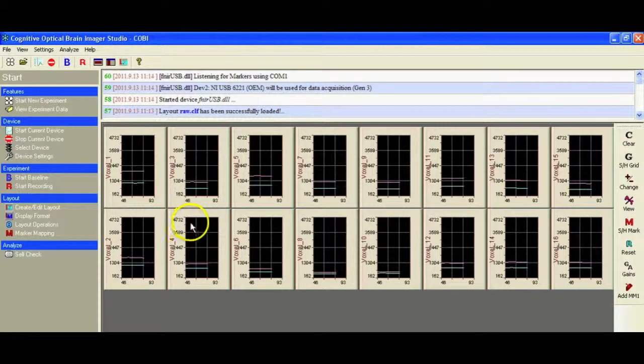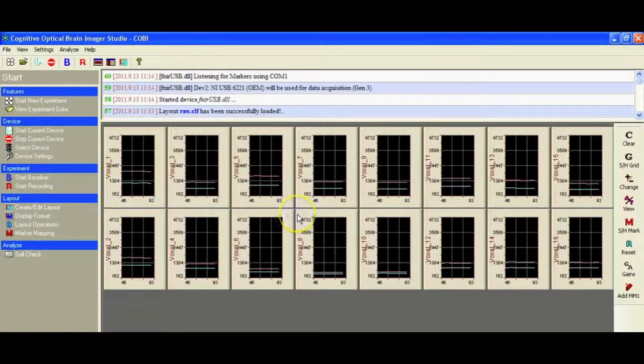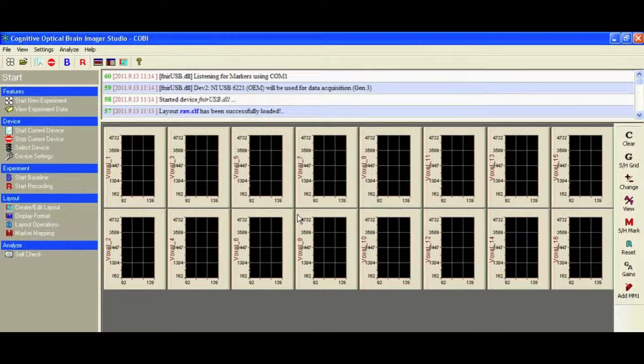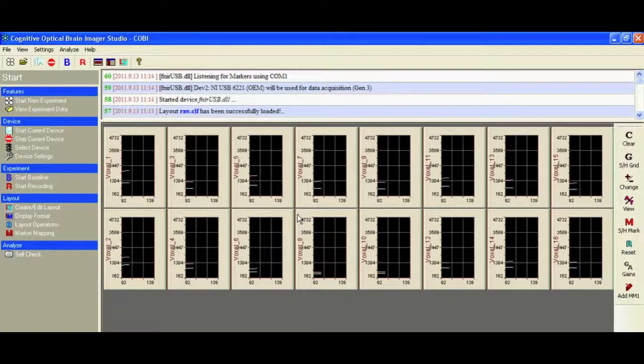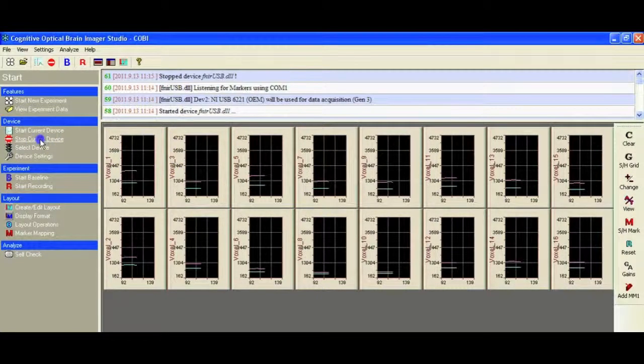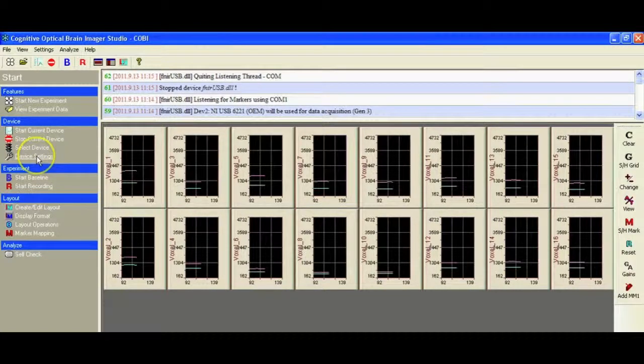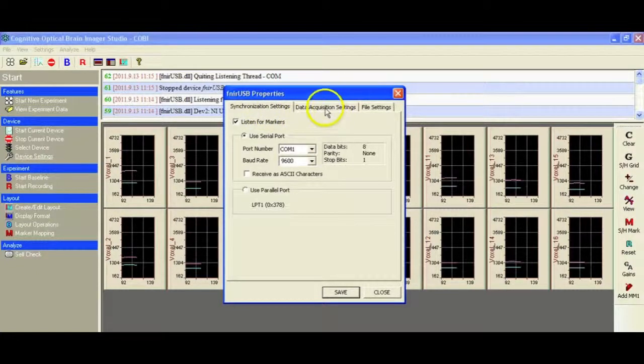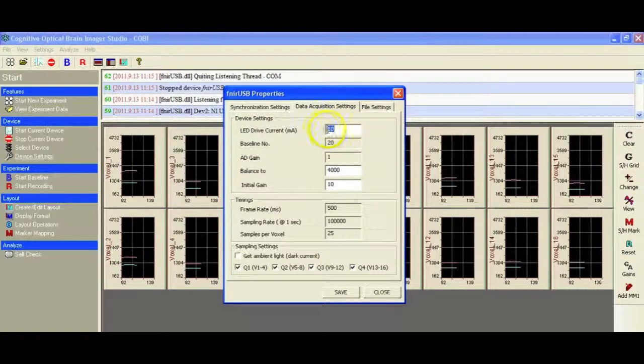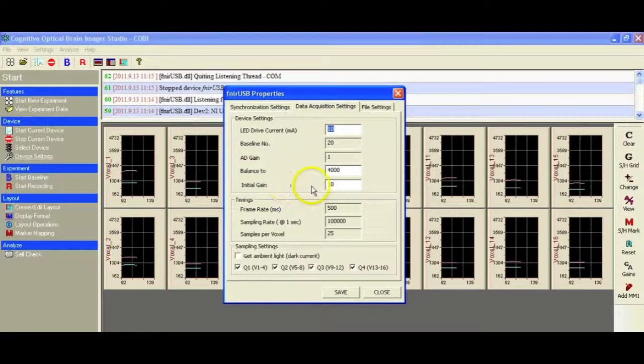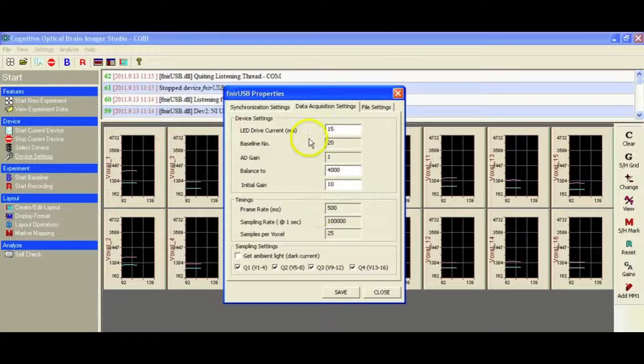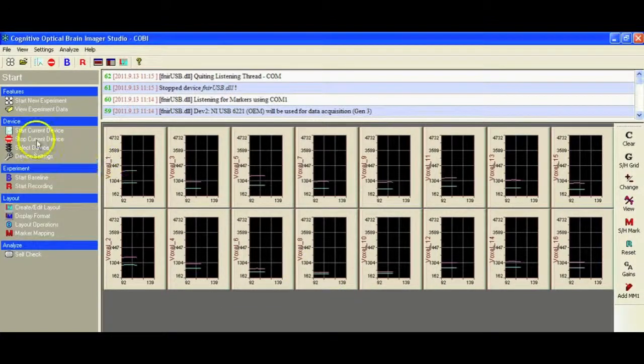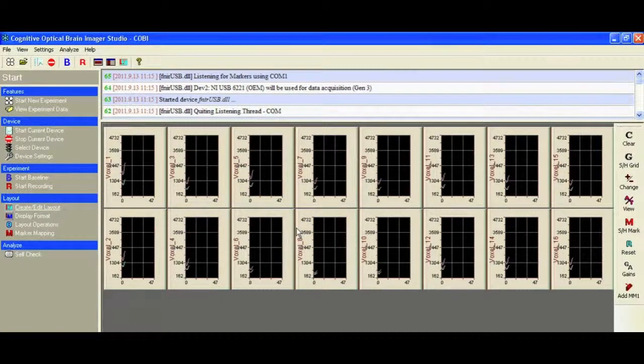Now, if we look at the display, we can see that most of these signals are falling in a pretty narrow band. The optimal range is between 700 and 3000. There are some things that we can do to adjust these levels. To start off with, if we stop the current device and we go into device settings, it's a multi-tab dialog. The tab we require is data acquisition settings. The default here is to have the drive current, the LED drive current set to 10, and the gain set to 10. But if we just step this up to 15 and then we start the device again, we'll see our levels should increase a little bit.